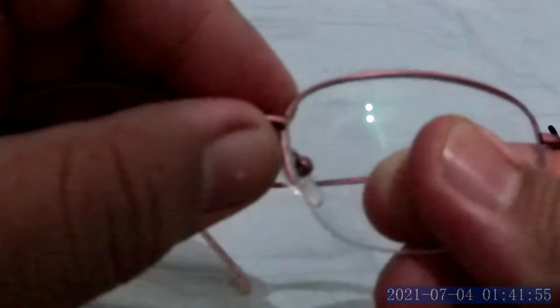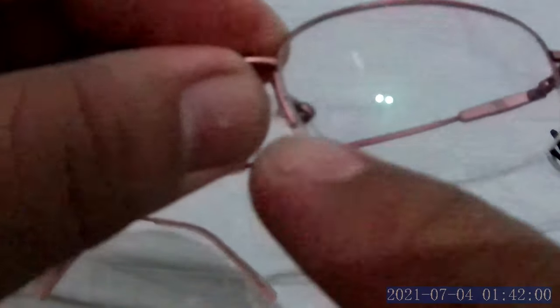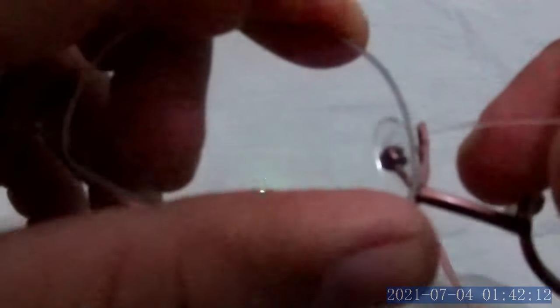Once you've bent the frame slightly, on the nasal part try to twist a little bit and you will see a gap. Once you see the gap, you can put the string in between. Put the string through the gap and make sure it goes all the way through. Then hold both ends of the string together and pull the string down.